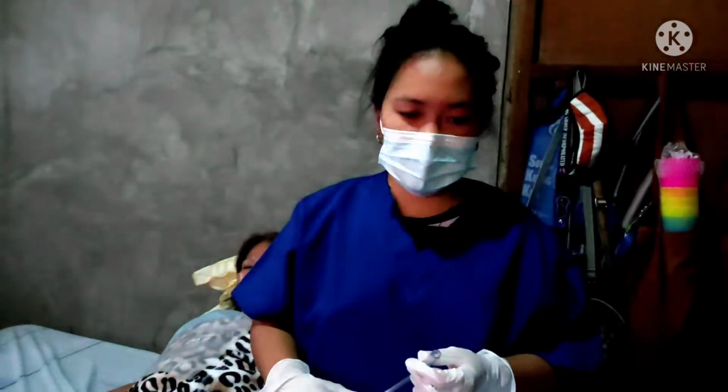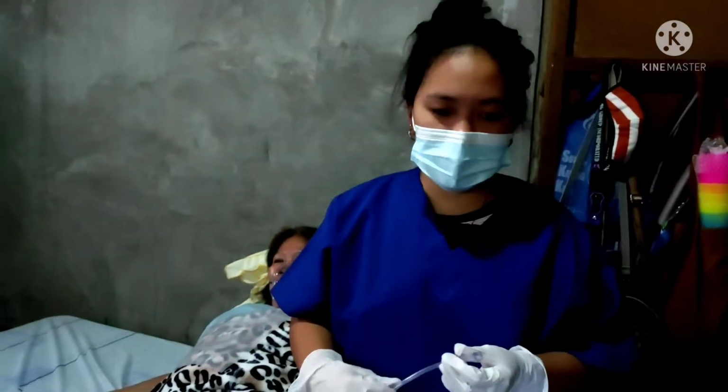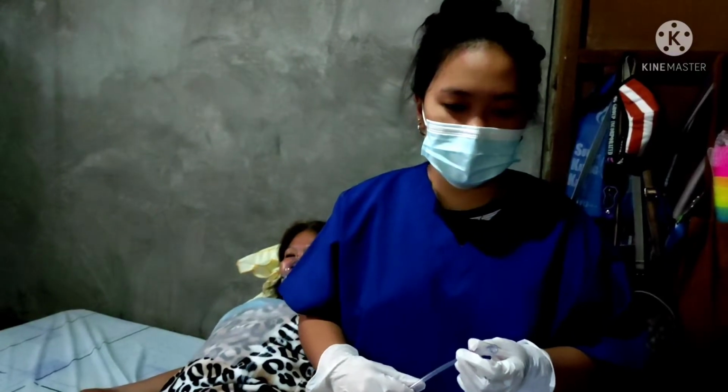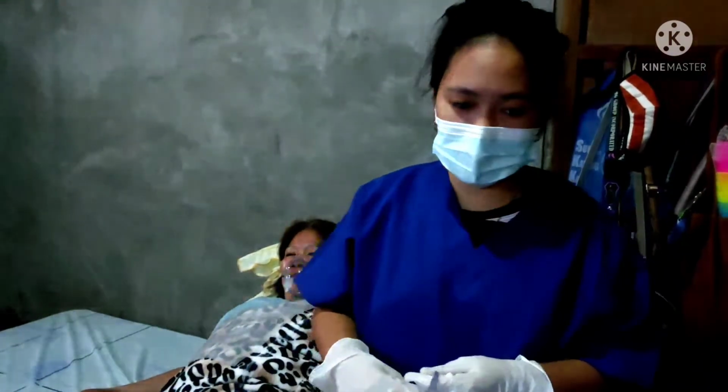Suction a small amount of normal saline from the basin. Increase the patient's prescribed oxygen flow rate, instructing her to breathe slowly and deeply.